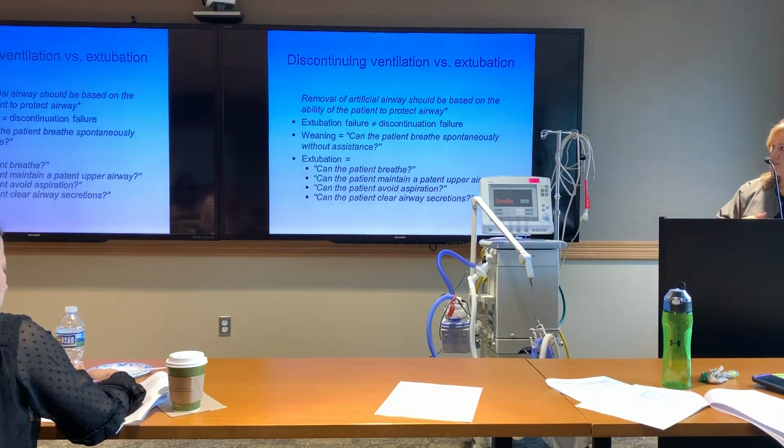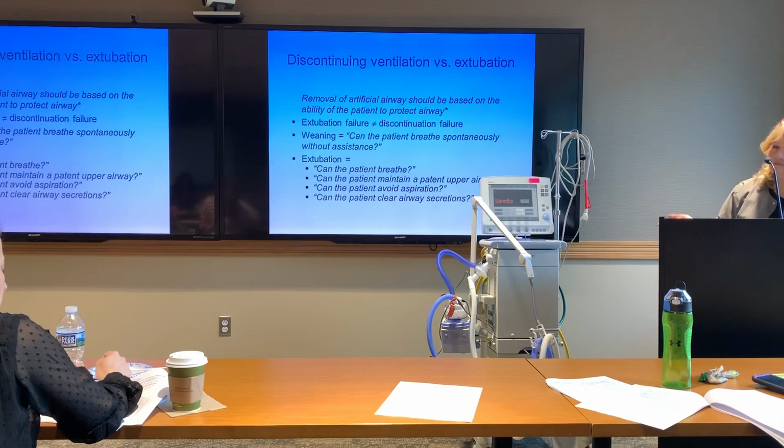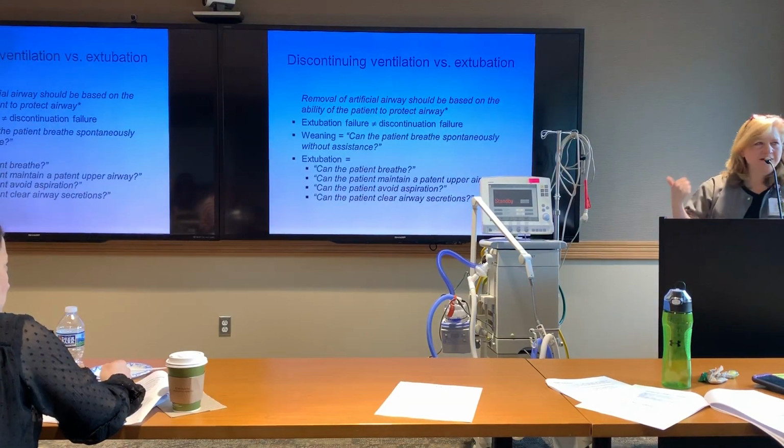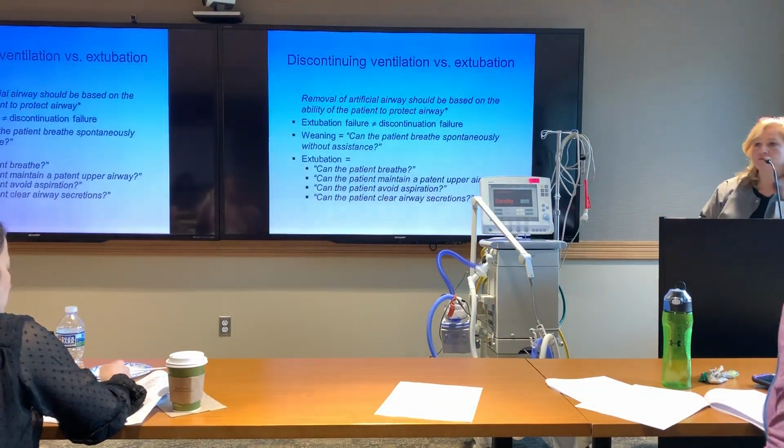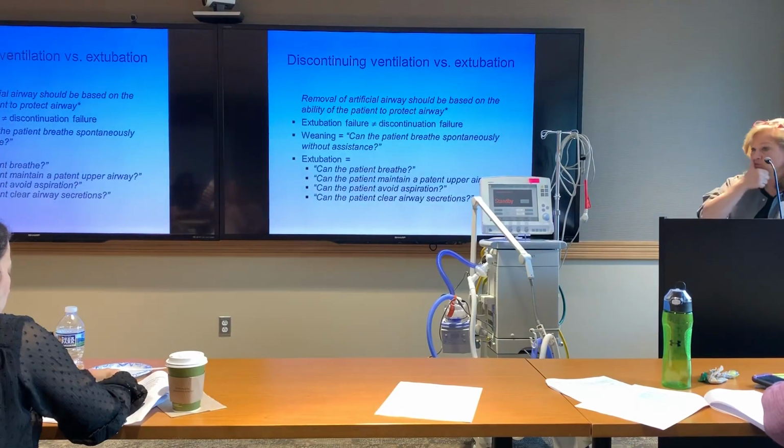Discontinuing ventilation versus extubation. Obviously, and you guys know this better than anybody else, patent airway, patent airway, patent airway. If they cannot protect their airway, we're not going to take that tube out, right? We can trach them, but we're not going to take the tube out. We can take them off the vent.